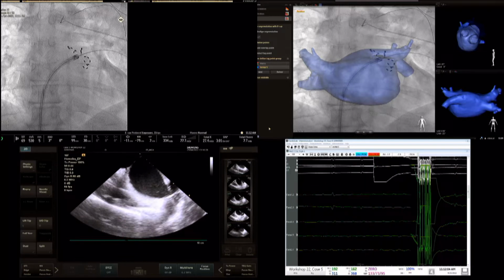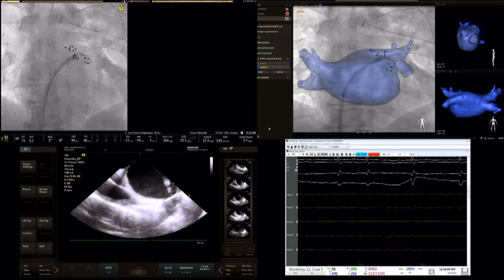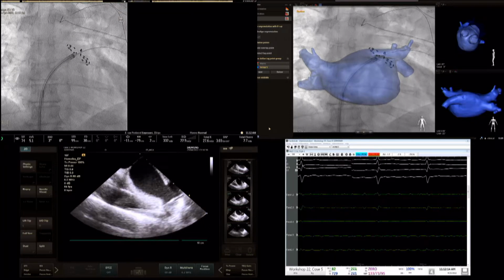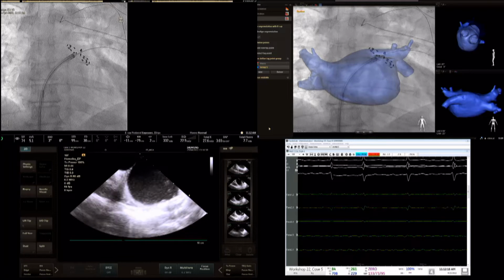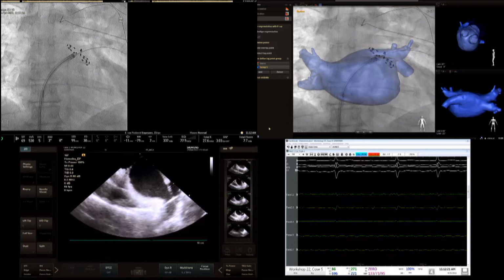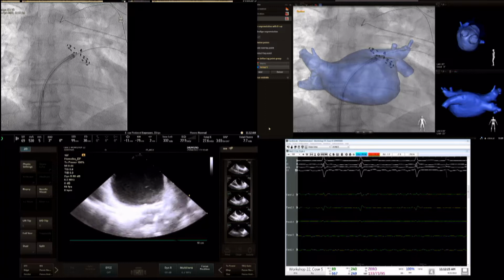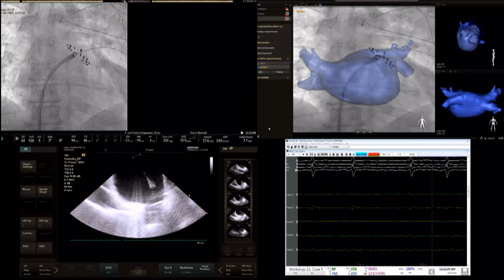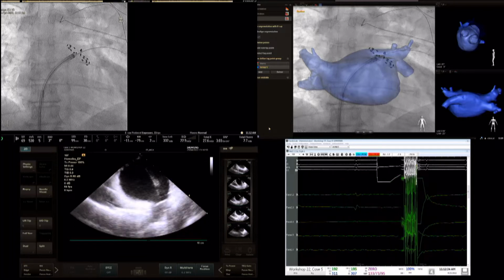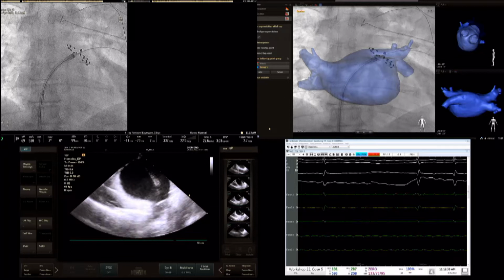Okay, let's rotate. I will rotate under floor. I really want to see the floor. Okay, now I rotate, and actually I'm not prolapsing, okay? I'm a little bit careful because it's a 35 millimeter catheter. Actually, we have 2 sizes, 31 and 35. So we are using 35 because of left common. Okay, let's go. And left common was calculated for like 28, 29 millimeters, so it should be okay. Last one.